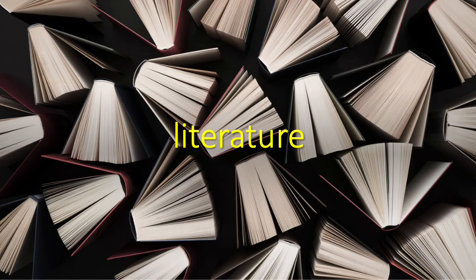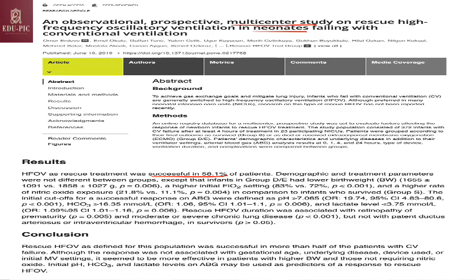Let's have a look at the literature. This is an important observational prospective multicenter study on rescue high-frequency oscillatory ventilation in neonates failing with conventional ventilation, and this was showing a successful rate in 58.1% of patients.